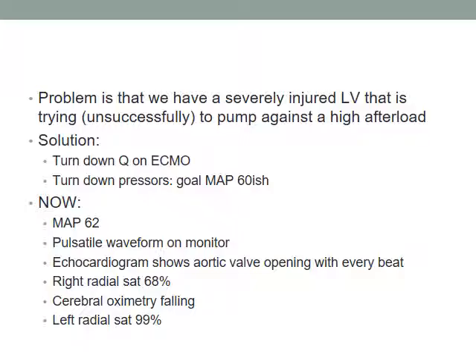So, when we did an echocardiogram, by the way, the LV was dilated, almost akinetic, aortic valve not opening. So severely injured LV, it's unsuccessful at trying to pump against a high afterload. Turn down the flow, turn down the pressors, aim for a lower MAP. Now, the question of adding a balloon pump, that is a little bit beyond scope.